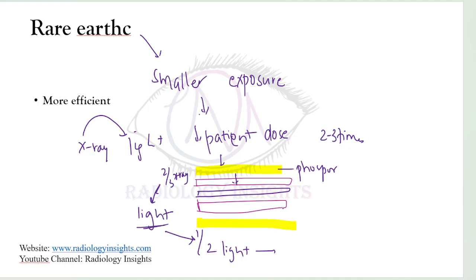The rear screen absorbs about half of the X-ray radiation transmitted from the front screen into the back, and about 2/3 of the total fluence is absorbed by the two screens in combination. Light from the back will expose the rear facing emulsion, and light from the front will expose the front facing emulsion. Overall, 2/3 of the total fluence, or X-ray photons, are converted to light.